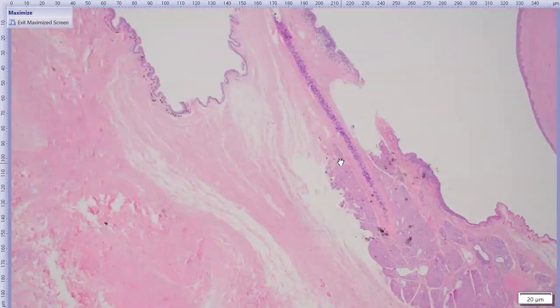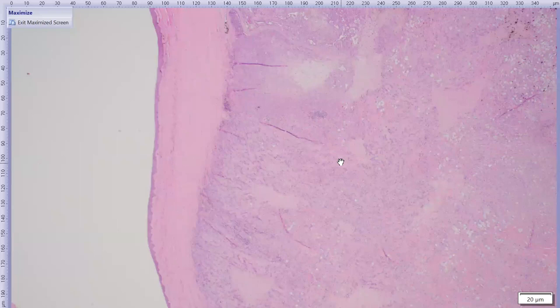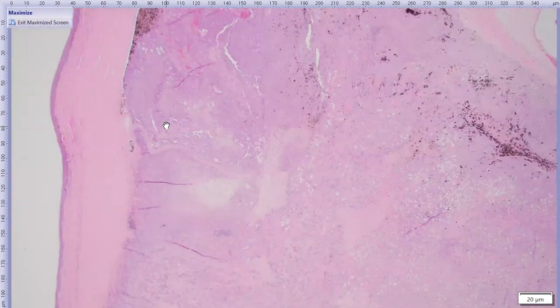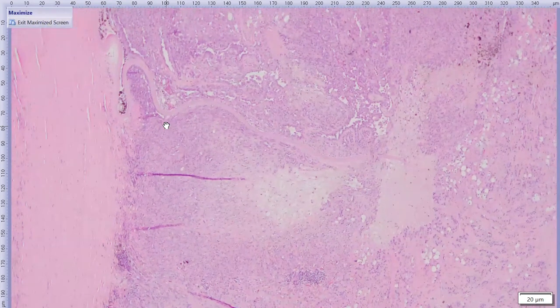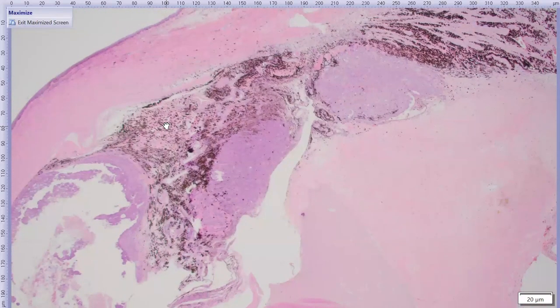All right. So eyelid with third eyelid gland. Here we've got cornea on the left, and then our mass that's just completely effaced the iris and ciliary body on this side. It was really difficult to see where that was. Here we can pick out some Descemet's membrane that the mass is kind of undermining, and it's all curled and distorted here. If we pass over the lens, on this side you can see a little bit better, similar to the previous case where the neoplasm is lining the ciliary body and iris, and it does have some similar features.